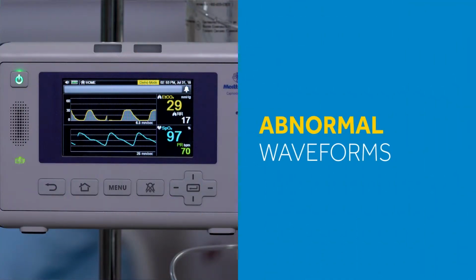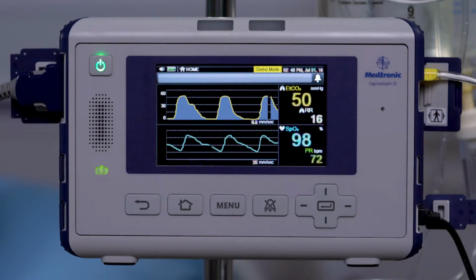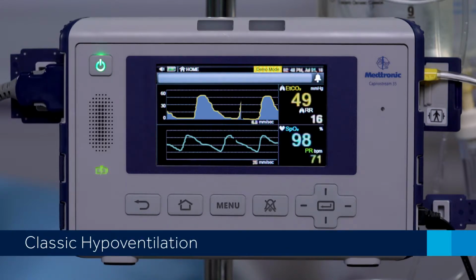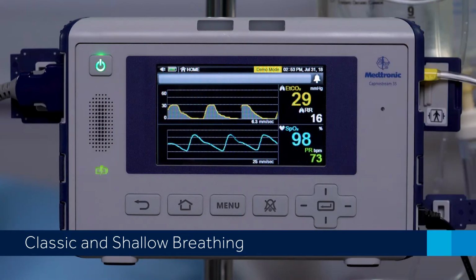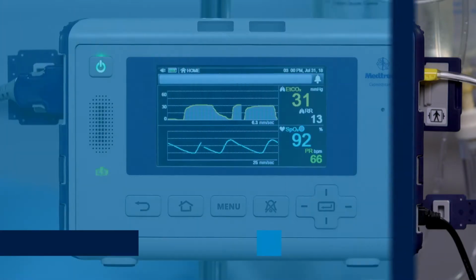Now let's review 4 common abnormal waveforms where you might see deviations in the capnogram characteristics. There are 2 hypoventilation waveforms, classic and shallow breathing. These are commonly observed during overdose, whether it's patient-controlled analgesia or general opioids. With classic hypoventilation, you may see a widened waveform with a high end-tidal CO2 value and a low respiratory rate. In cases where patients have hypoventilation with shallow breathing, the EtCO2 is low and the respiratory rate is normal to low.